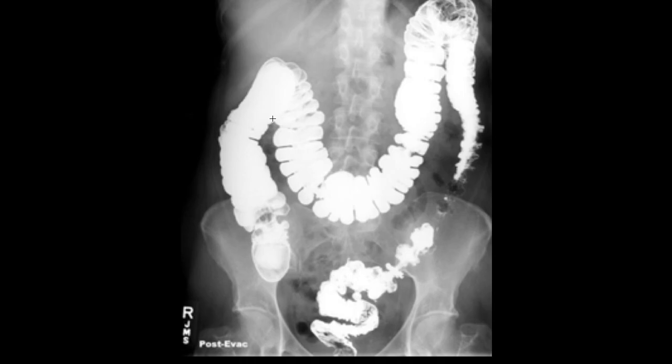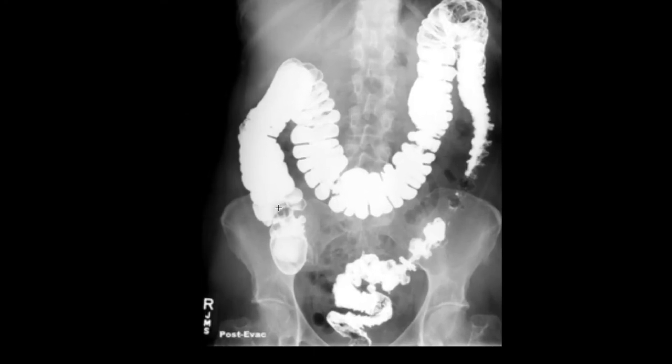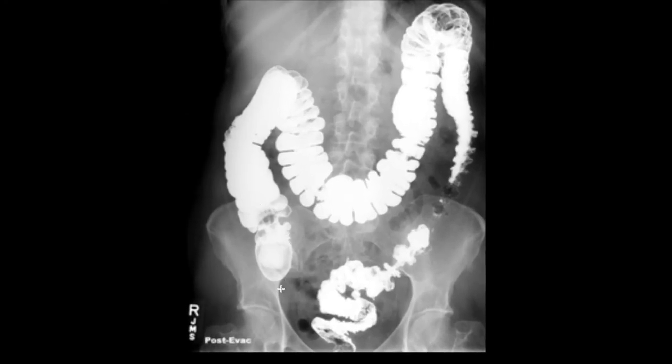Coming to the cecum, it shouldn't go beyond 90 millimeters, that's 9 centimeters. The cecum, here, this is the cecum. Yeah, the cecum is indicated as the first part of the large bowel. It joins with the small bowel at the ileum, forming the ileocecal valve. Okay?